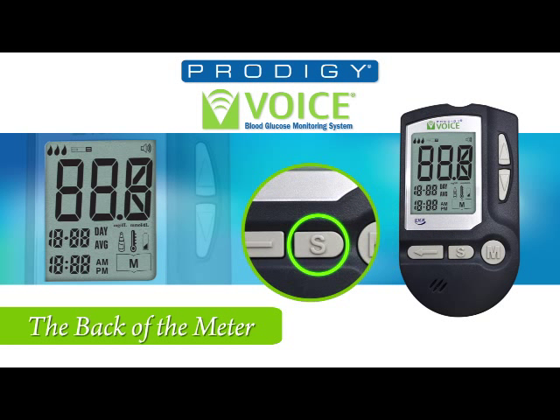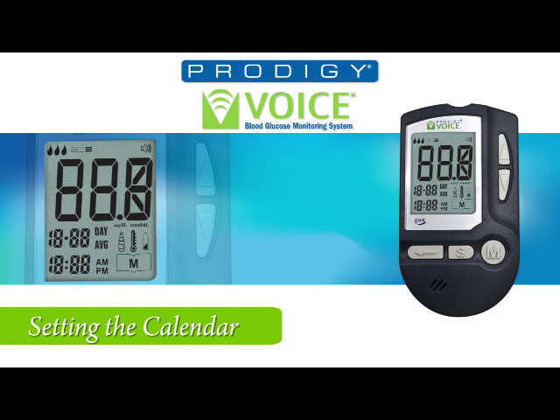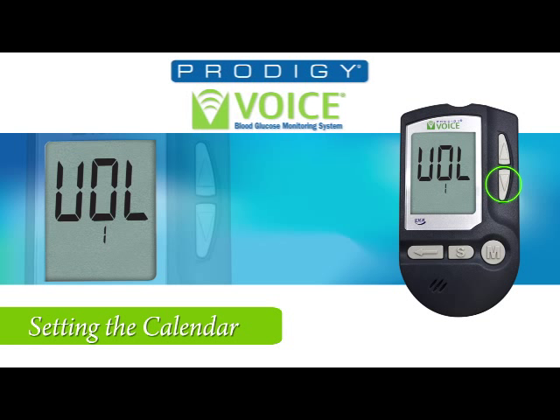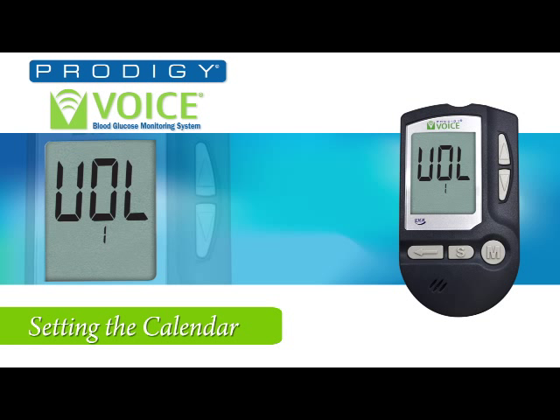Now flip the meter back to the front and use the set button on the front. You will hear: 'Your Prodigy Meter is on. You are now in setting mode. Volume level 2.' You may now press the up or down buttons for desired volume level, from 0 — no sound — up to 7, the meter's highest sound setting.